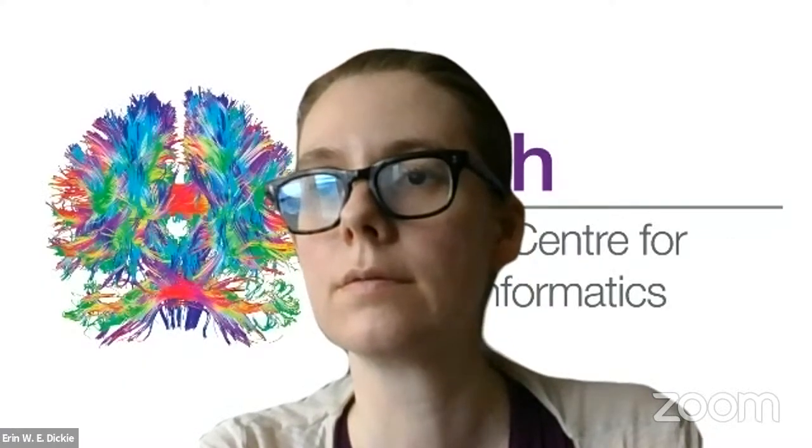If that still doesn't work, you might need to module load Singularity. So yeah, we'll talk about containers tomorrow. They've created a container for doing the BIDS validation instead of using the web browser. And I guess tomorrow we'll talk about using other containers like MRIQC for QCing your data and fMRIPrep for preprocessing fMRI data.